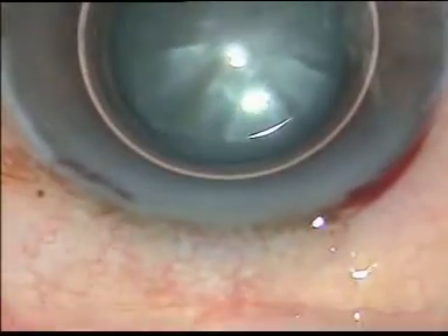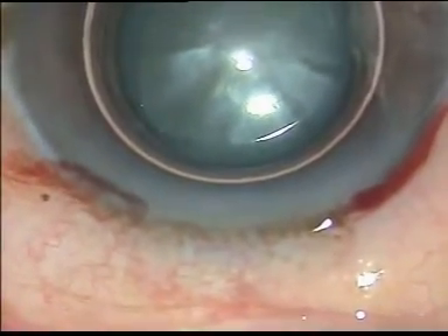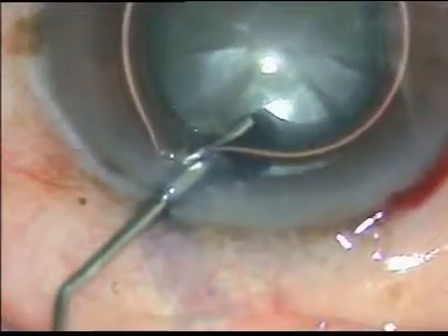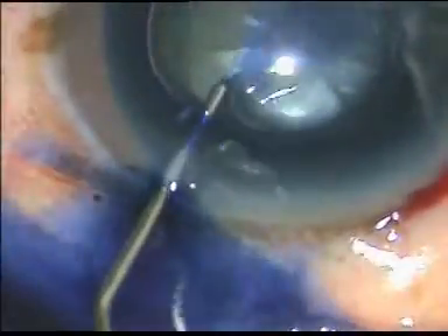Hello friends. I am going to show how I do capsulorhexis in intumescent cataracts. This is an intumescent cataract. The main incision has been made, a side port has been made, and an air bubble has been injected. Now I am giving trypan blue dye in the anterior chamber to stain the anterior capsule.